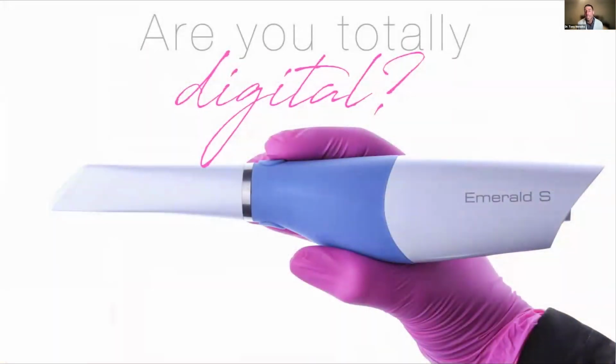And I guess what I would ask people nowadays, this is more of a common thing, is are you totally digital? In our practice, we don't have the ability to pour up stone, right? So if we have a patient who comes in and they want a whitening tray, or something that requires a simple procedure, but we can't create a model because we don't have stone and all the necessary things, because we don't take physical impressions, everything's digital. So we have a printer that we can use to make that.